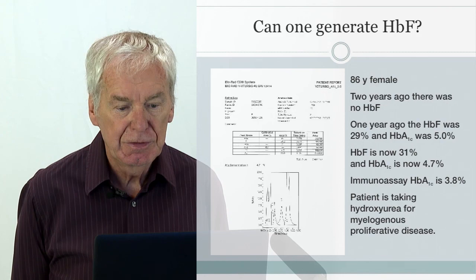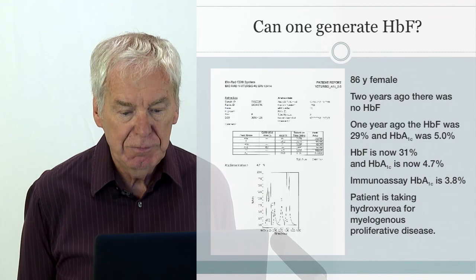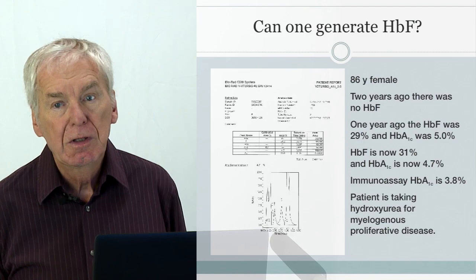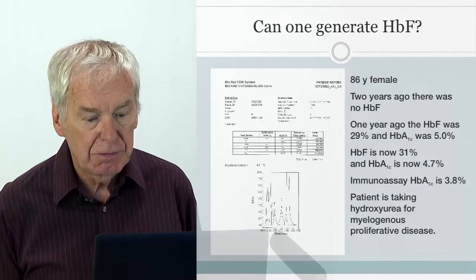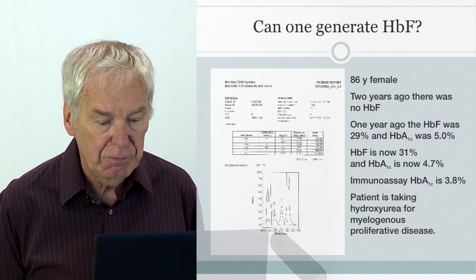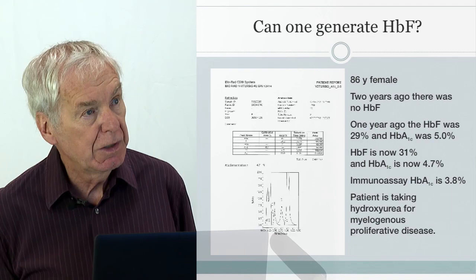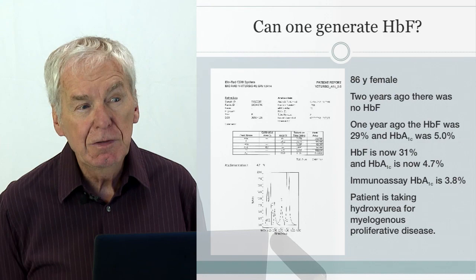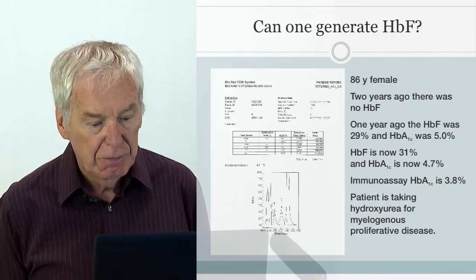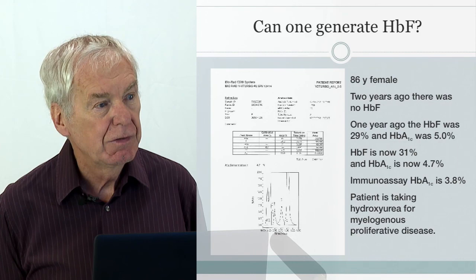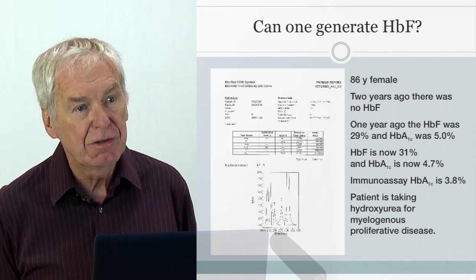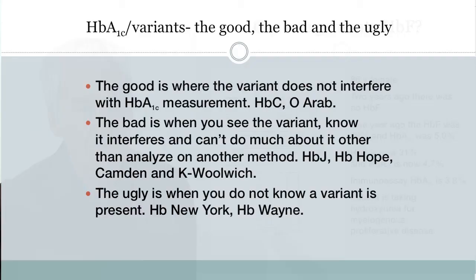Can we generate hemoglobin F in adults? The answer is yes. An 86-year-old female had an A1c performed two years ago with no hemoglobin F. A year later, hemoglobin F was 29% and A1c was 5.0%. Now hemoglobin F has risen to 31% and A1c is 4.7% — whereas on immunoassay it was only 3.8%. How can an 86-year-old generate hemoglobin F? She was taking hydroxyurea, which increases the production of hemoglobin F and is often used as an adjunct in chemotherapy.